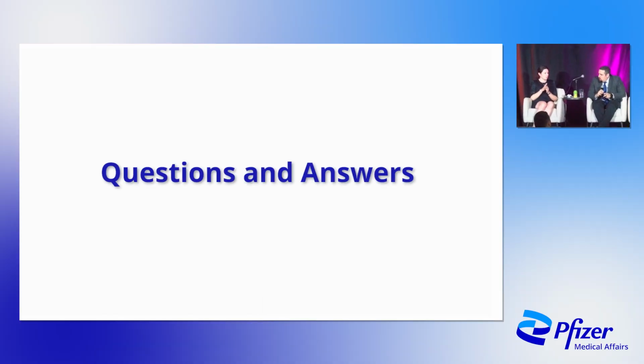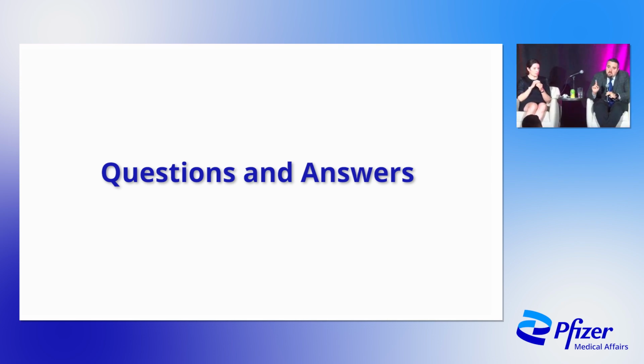I would add two more points to these excellent points. One is that asymmetric hypertrophy does happen in amyloid. It's not the norm, as Dr. Kari was saying. That lateral base thickening is really a good sign, but don't rule out amyloid just because someone has asymmetrical hypertrophy, especially if the lateral wall is still thickened. The lateral wall could be 12 millimeter, could be 11 millimeter, but your septum could be 16, 17. That doesn't mean that the lateral wall is absolutely normal.